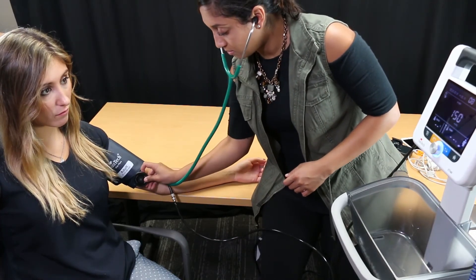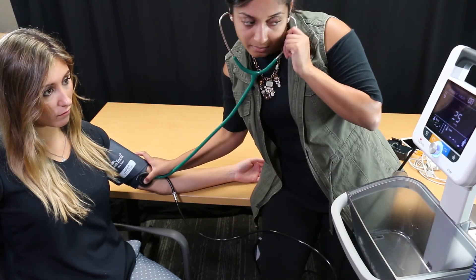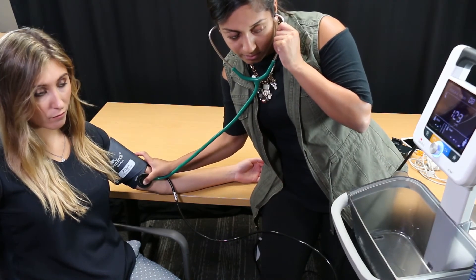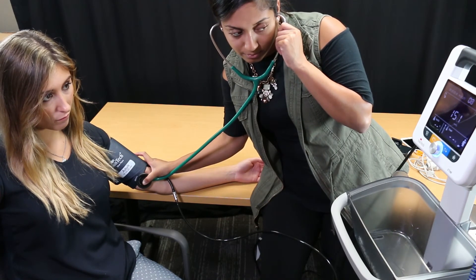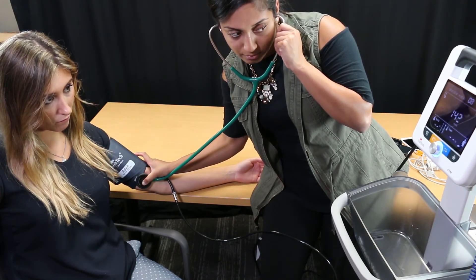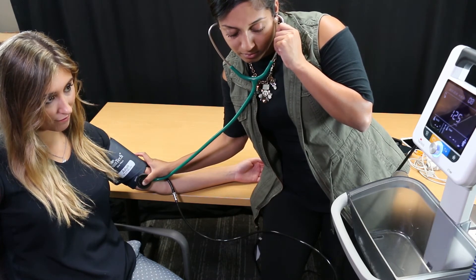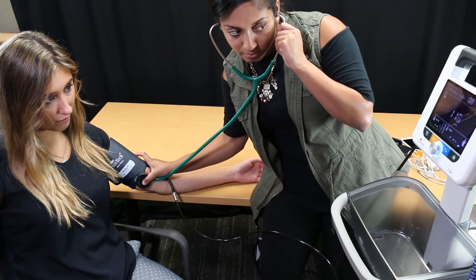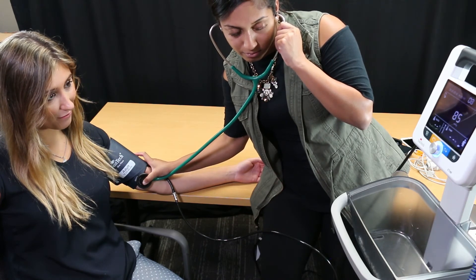Place the stethoscope over the patient's artery. Press the start stop button to inflate the cuff automatically — the display shows you the current pressure in the cuff. When the cuff reaches maximum pressure, deflation begins automatically. Listen for K sounds while watching the displayed pressure, paying attention to the systolic and diastolic pressures. Press the start stop button once again to quickly dump remaining pressure from the cuff.